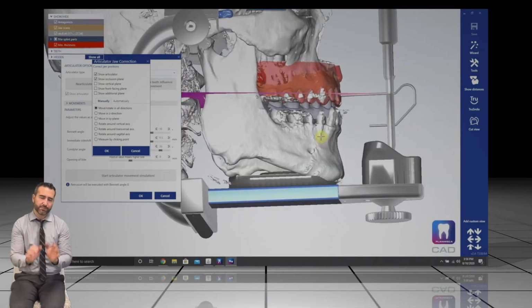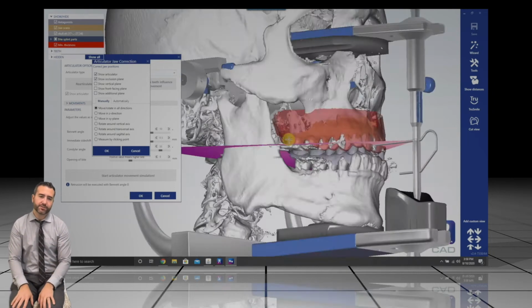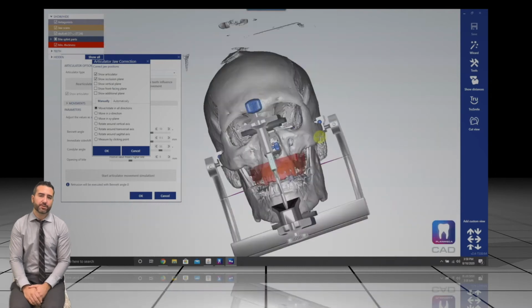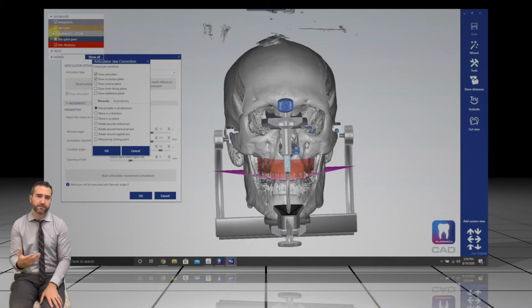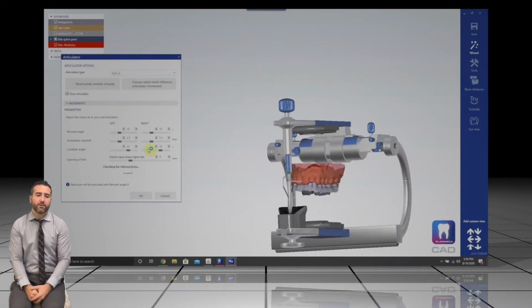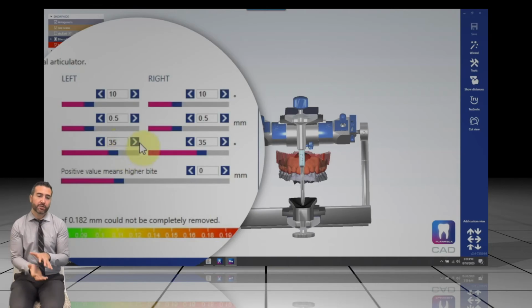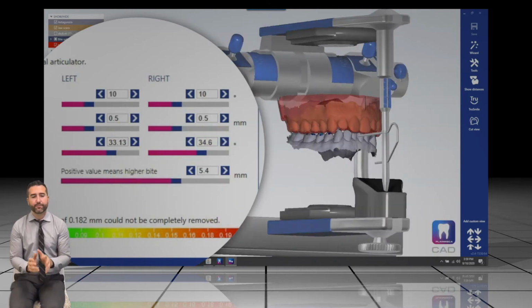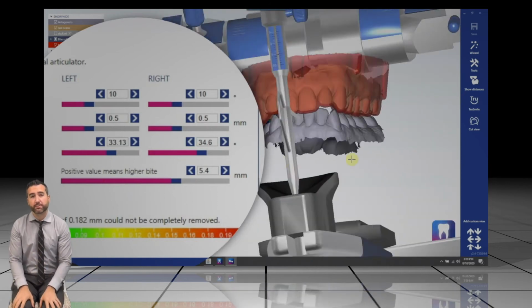This is kind of the ultimate face bow mounting, if you will, because you're using actual values from the patient versus some arbitrary and empirical values from something else. And so when we go through and now we open the articulator pin, plus we're dialing in the custom articular eminence here, of that condylar inclination, we're able to get better values for our occlusal appliances.